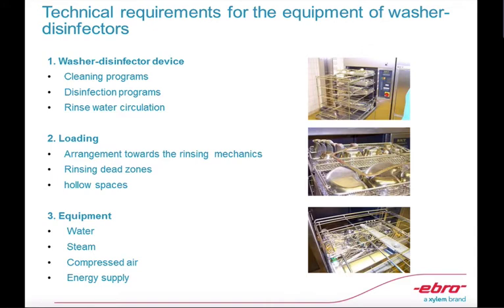And third, the equipment and the utilities. Equipment and utilities is very important because it has all the important ingredients to complete a successful washer disinfection process.